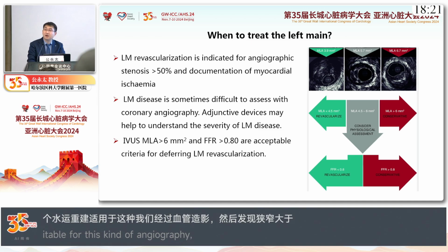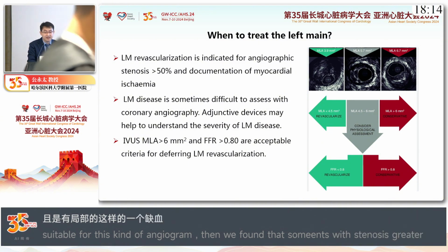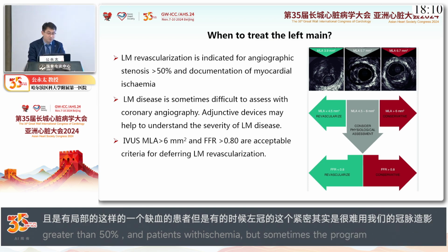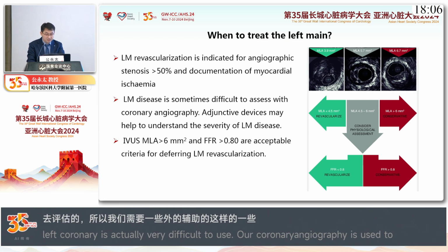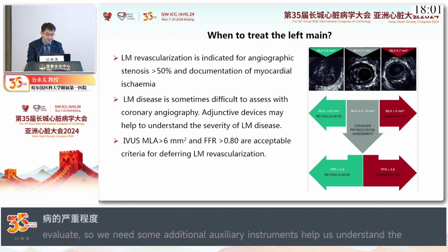Of course, left main disease is sometimes difficult to assess with coronary angiography. So, adjunctive devices may help us to understand the severity of left main disease.